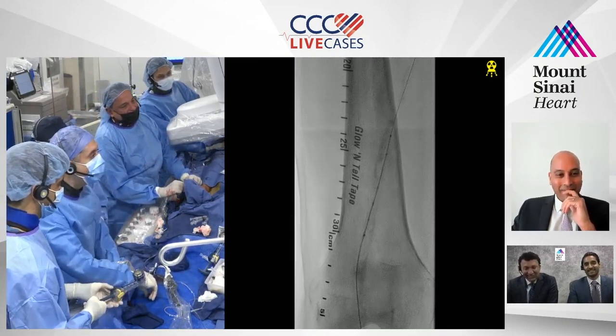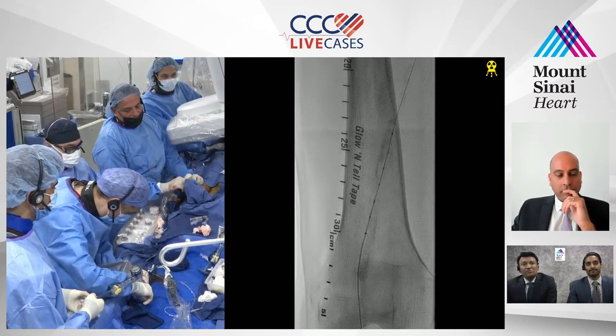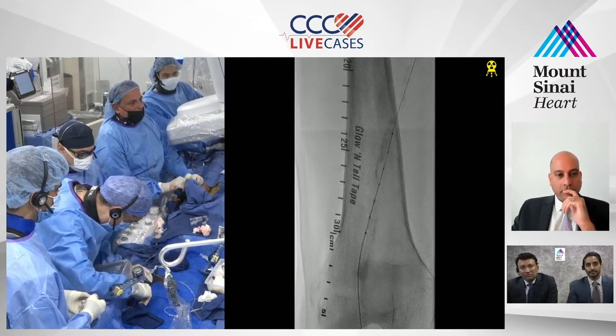Exactly. What's your atherectomy of choice for calcium then? Do you have a device that you prefer? One second. Calcium, that's a great point.